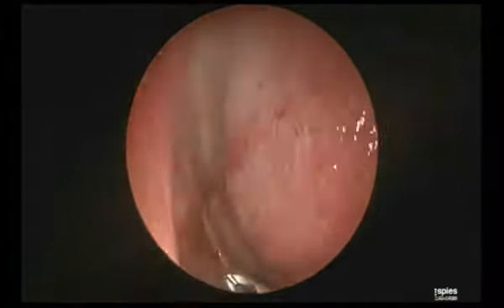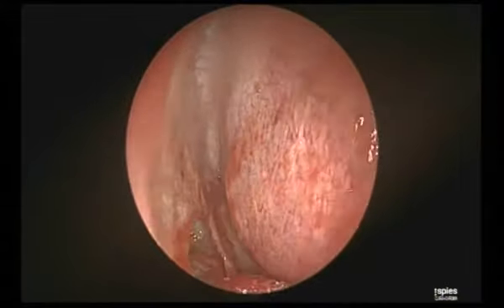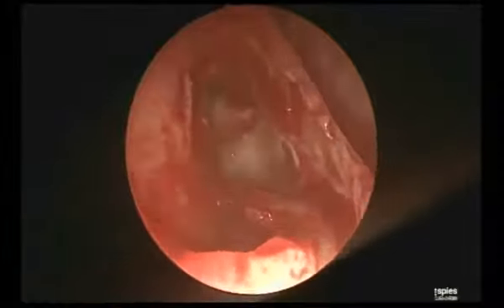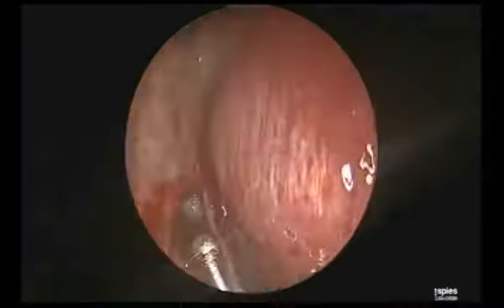This is again, I think, with the 70. Looking at the anterior ethmoidal, it's a great move. Until now you are working there, there is no anterior ethmoidal in the picture. If you work anteriorly, forget about the fear of the anterior ethmoidal. The anterior ethmoidal is much more behind.